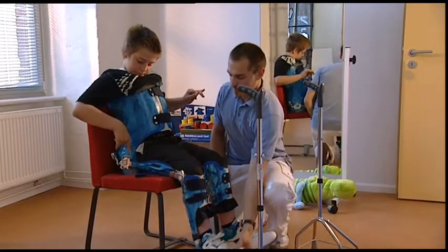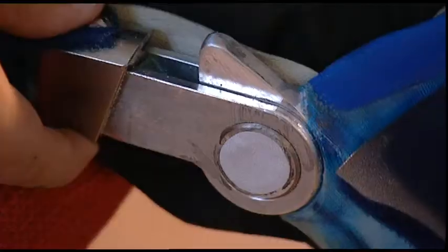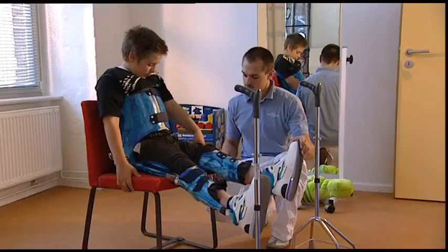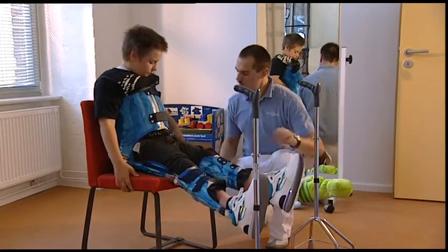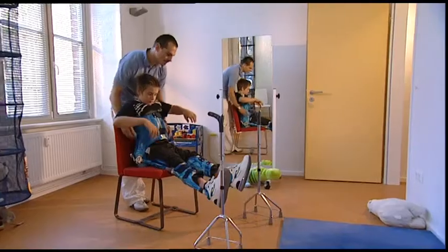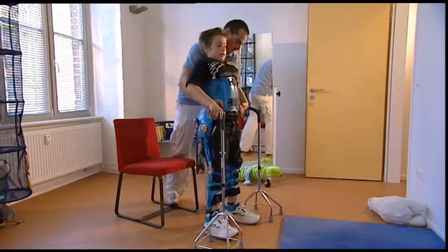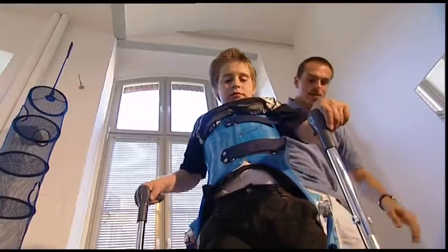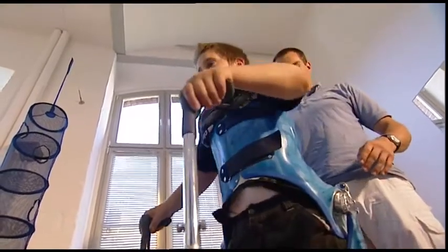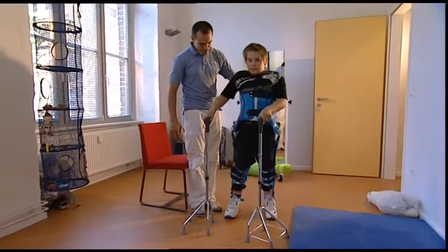Whenever young Randy wants to stand up, first the knee joint is fixed. Consequently the hips stretch. By pressing the pre-select button before moving upright into a stable standing position, the hip joints give way to a pelvic rotation during walking, resulting in a more physiological hip position while enhancing the pace with less energy needed.